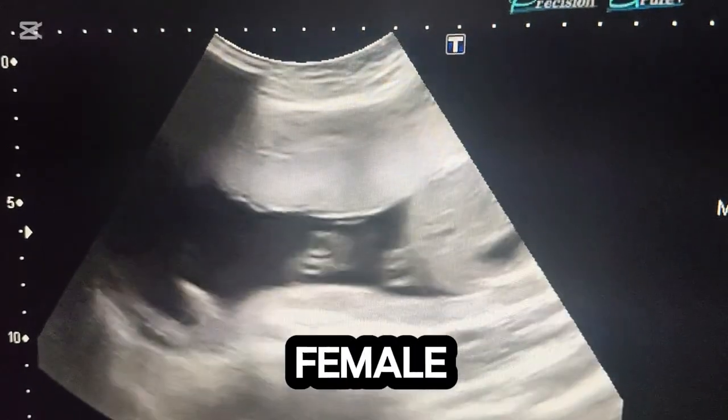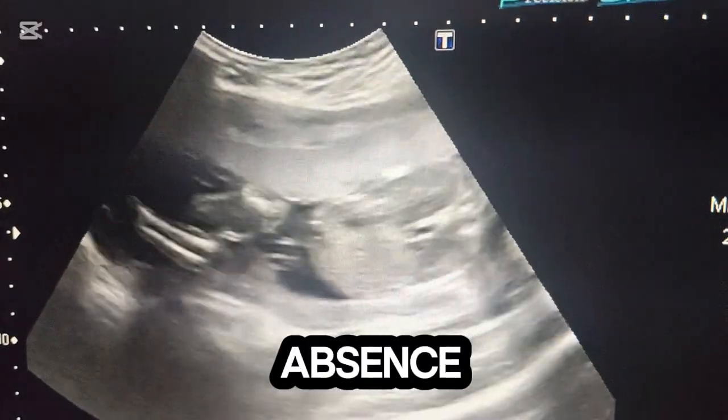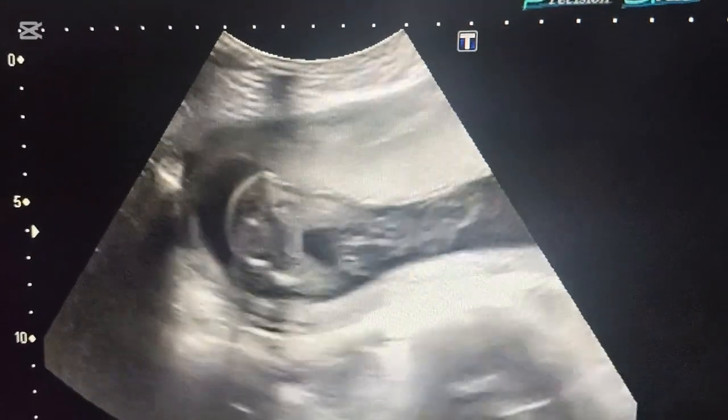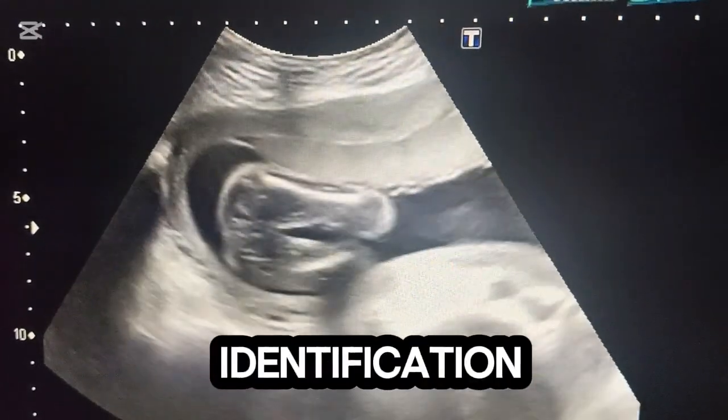Ultrasound suggests female fetus, evidenced by absence of male genitalia and visualization of labial structures, confirming baby girl gender identification.